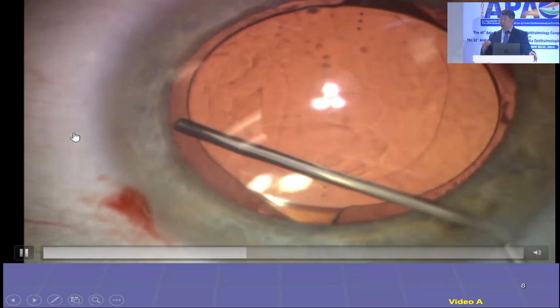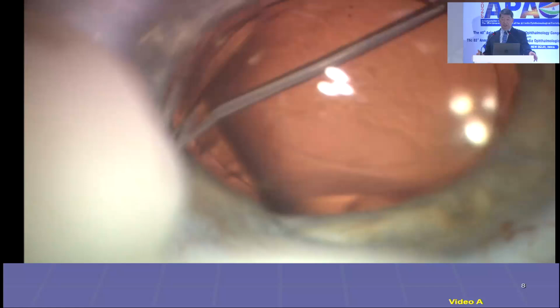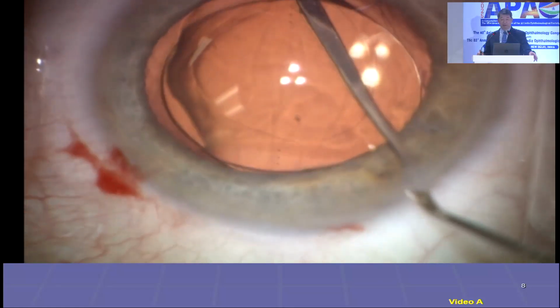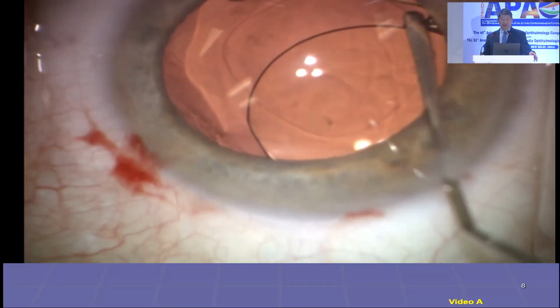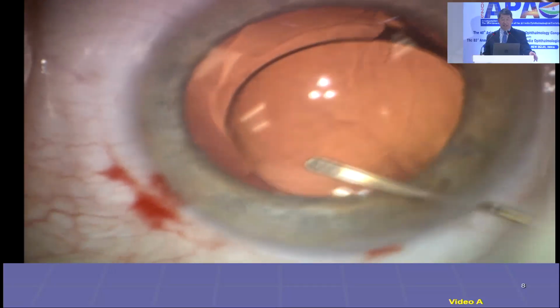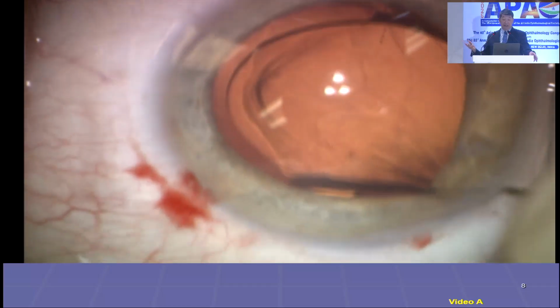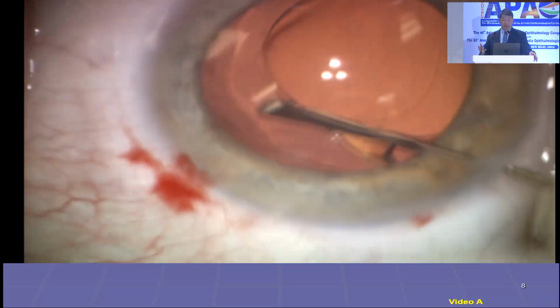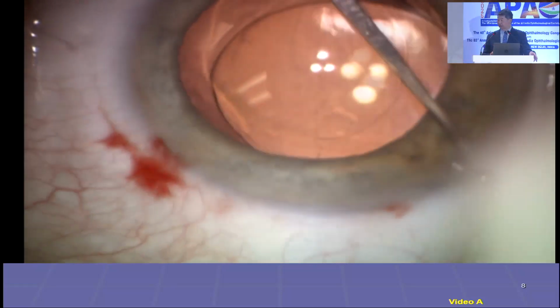I'm going to put the viscoelastic in, and it opens up pretty well. Okay, so this is what Kumar was saying. Let's try to inflate it. Amar would have already finished the PRK by this point. And look at the left-hand side, though. I'm rotating it because I need to go 140 degrees now. And can I get that haptic free? Yup. It's pretty. Look down below. Did you see that? Yeah.